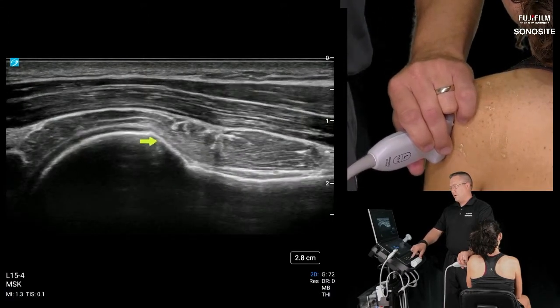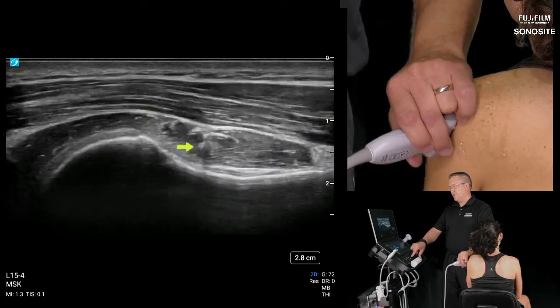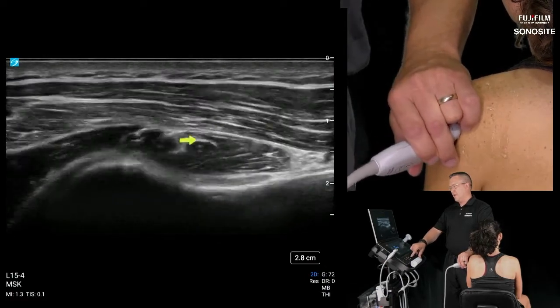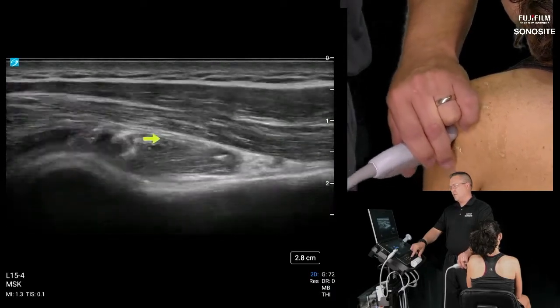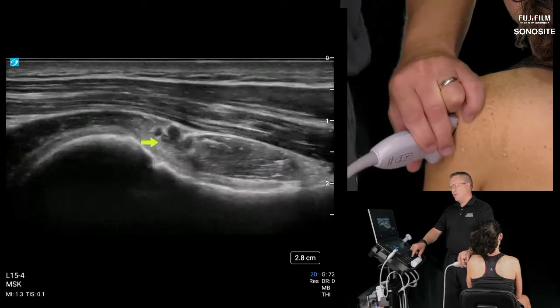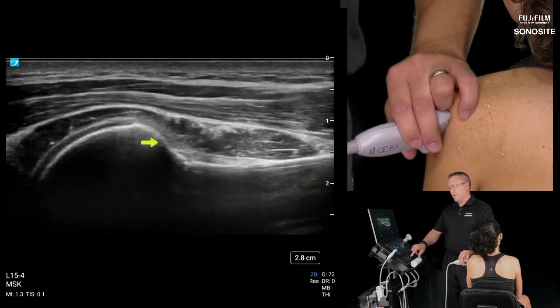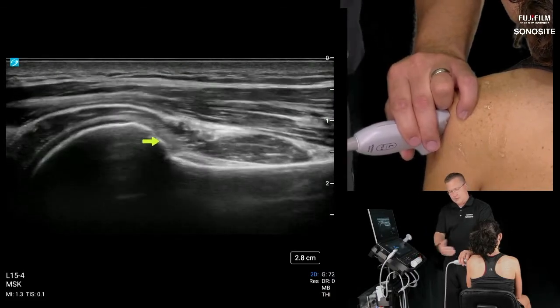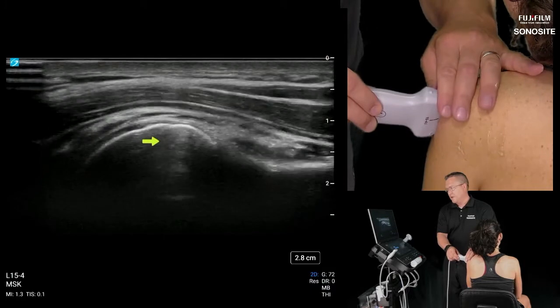So here's that humeral head, neck. This is all teres minor here, muscle belly. Okay. And then right here is the central tendon. It's a bit superficial compared to the infraspinatus, for example. And what I'm going to do now, just like in the PowerPoint, this being my home base view, is go laterally to its insertion on the inferior facet.